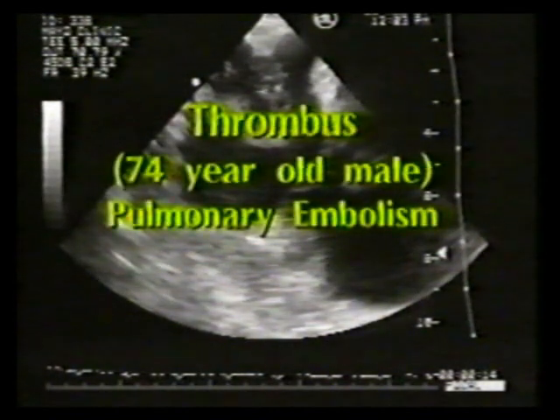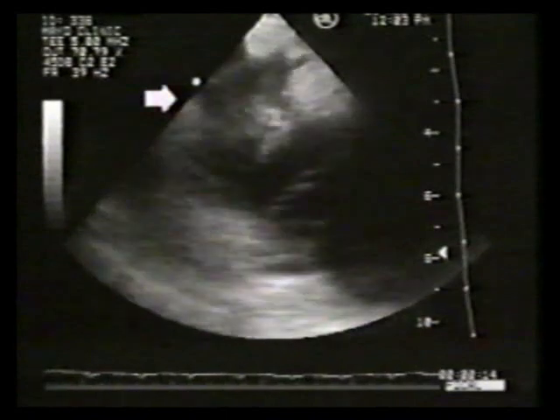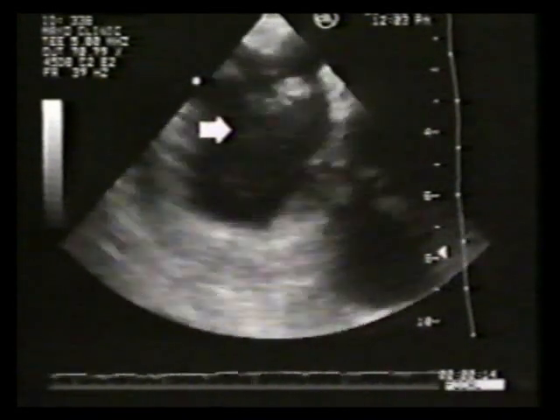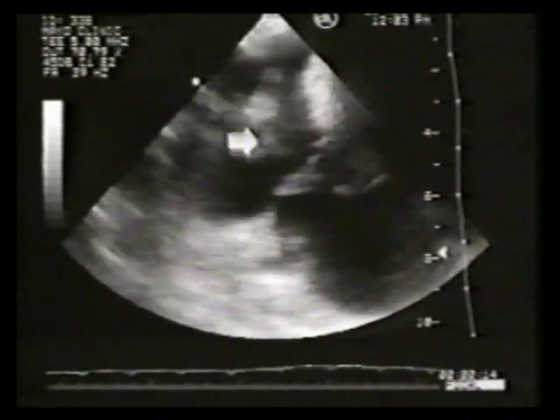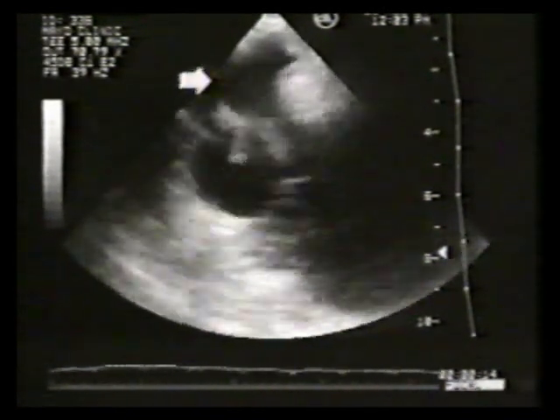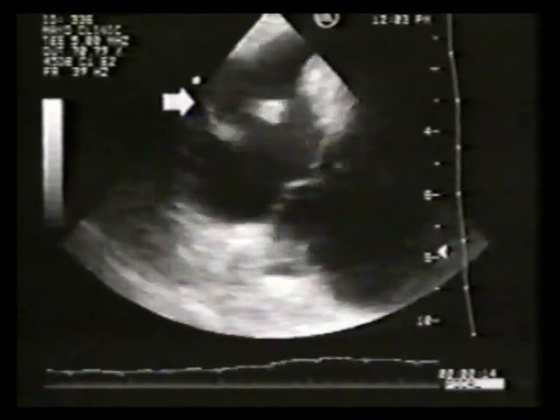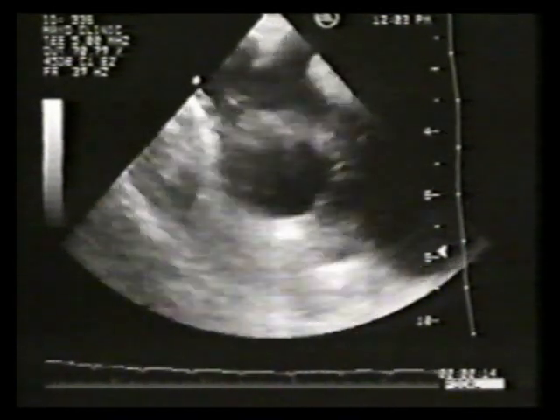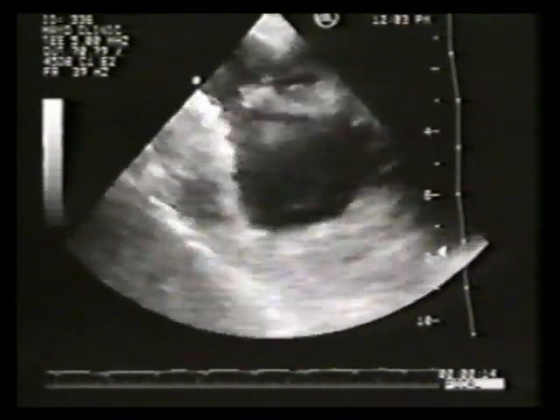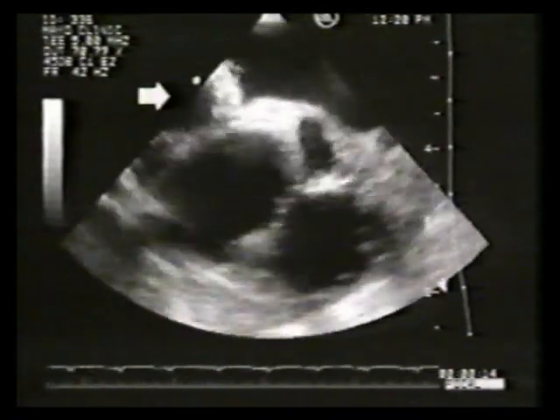The next example of thrombus visualization is in a 74-year-old man presenting with clinical pulmonary embolism. The right atrial cavity is visualized, the tricuspid valve, and right ventricle. Within the right atrial cavity is an undulating, multifaceted mass consistent with peripheral embolization of thrombus. The thrombus was adherent to the eustachian valve and was captured in the right atrium.